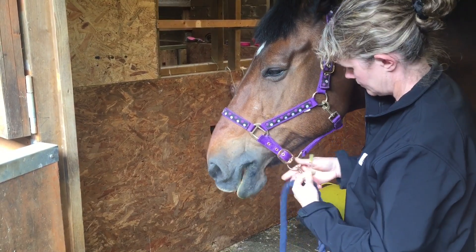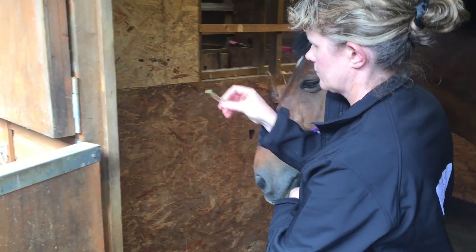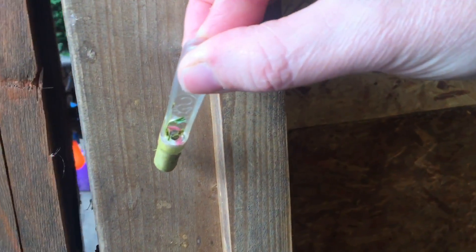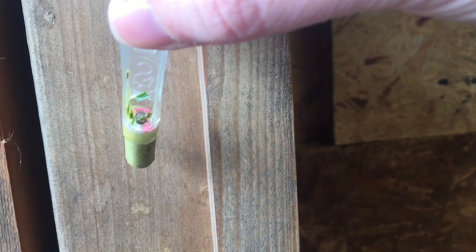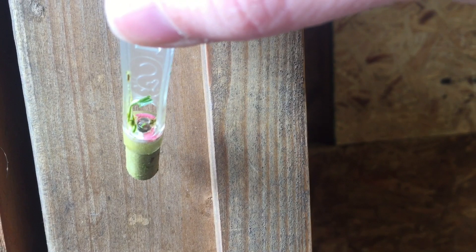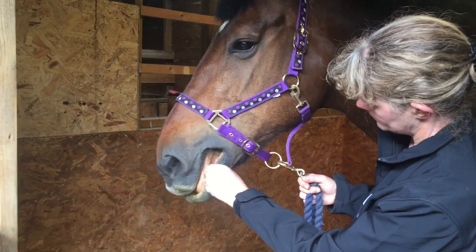After a further 30 seconds to a minute, check the colour change indicator. This time more than half of the window has turned pink. Here you can see some debris present on the window area; this can be removed with fingers or a clean tissue to be able to see the window properly if needed.